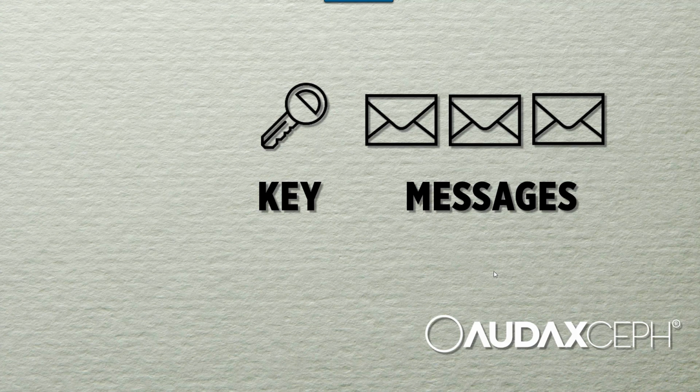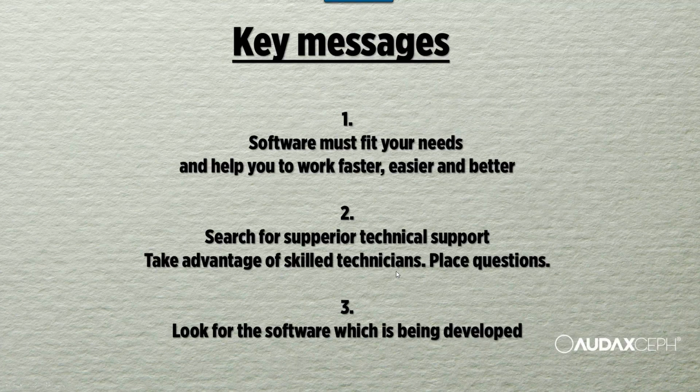I would like to point out three key messages about what is important for your orthodontic software. First, it must fit your needs. This means that it should work for you. You should benefit from it. Be faster, work easier, be better.